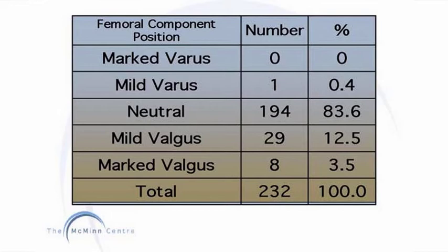We also assessed radiographically the position of the femoral components. If the component is placed too varus, the uneven stresses from the head would fracture the neck. If placed too valgus, there is the high risk of notching in the neck and leading to a fracture. Precise positioning of the components is essential.